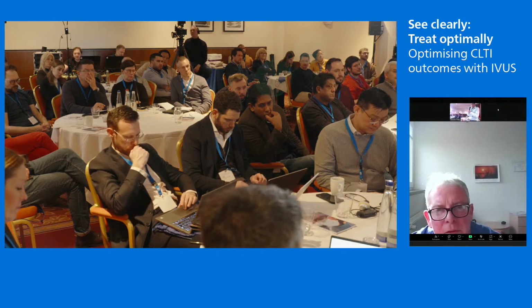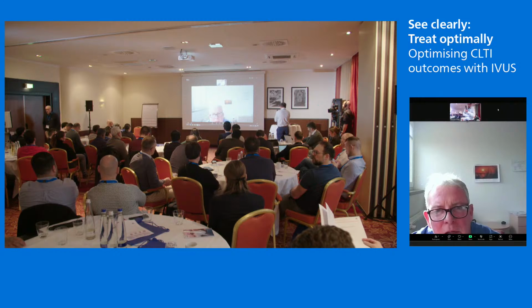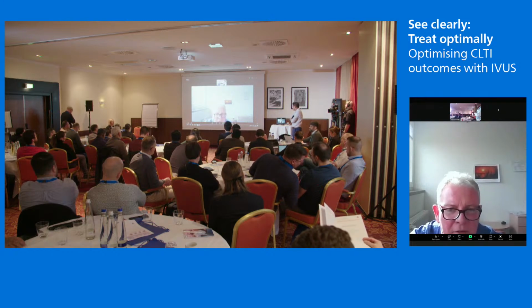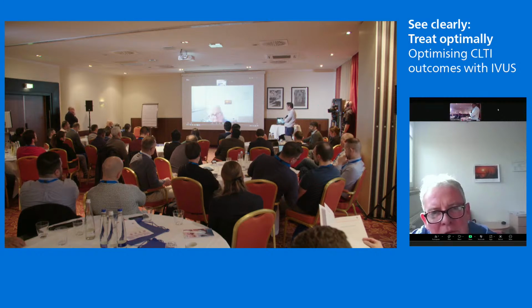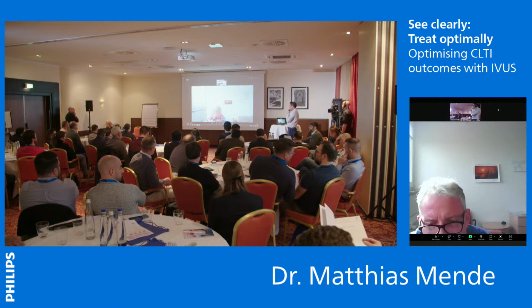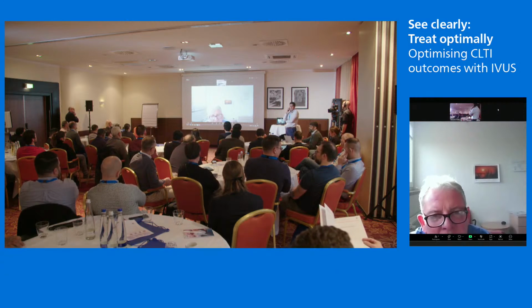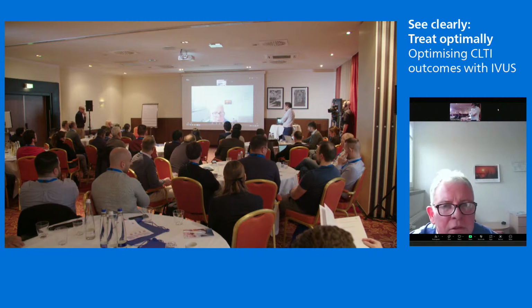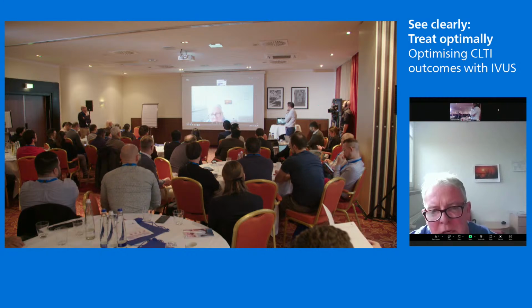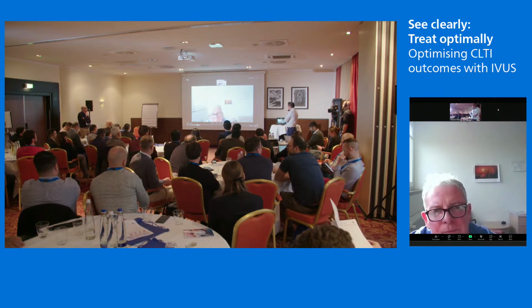And how about trackability? Is it quite good for up and over in terms of trackability, or are you often antegrade only? No, it's a crossover because it's very flexible, which is different to other devices. Like my Rotarex snapped a few times if you have a steep angulation, a steep aortic bifurcation. And the BiCross device I'm using quite often is as well not good in steep bifurcation. That's a lot easier with the laser, definitely, because it's so soft and it can just go around if you have a 7 or 8 French sheath. And then you have less friction. So if I have a steep bifurcation, I use a bigger sheath so that I have less friction.